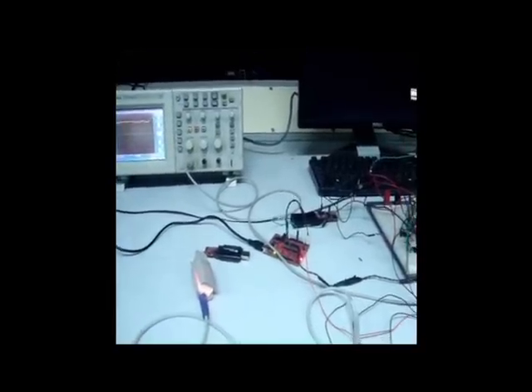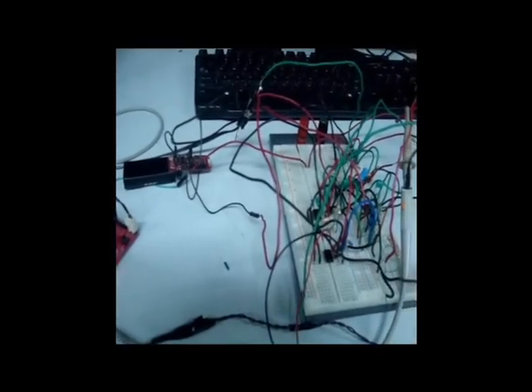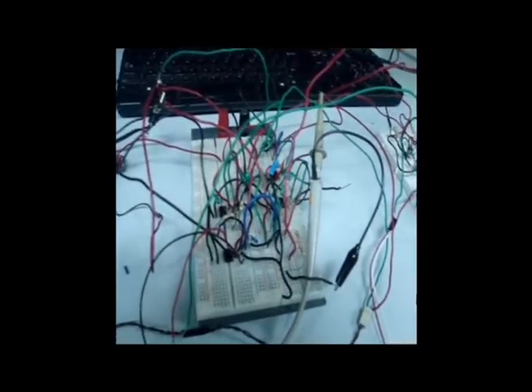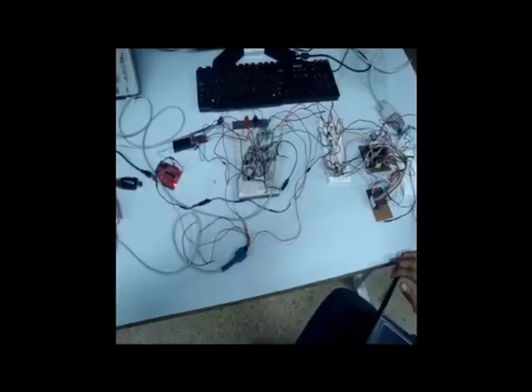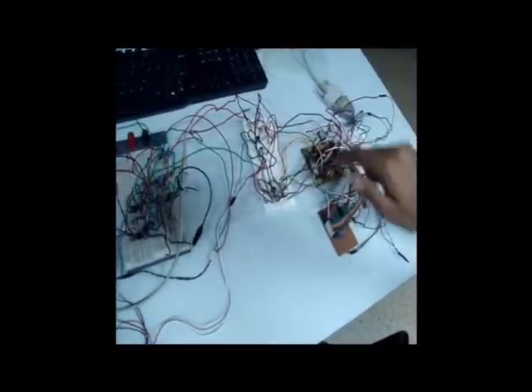The output of the pulse oximeter is called the photoplethysmograph, or the PPG. It contains the information about heart rate and oxygen saturation. Our device will extract this information and deliver results in real time through a wireless mode. Our system is divided into two modules, the analog front end and the microcontroller module.